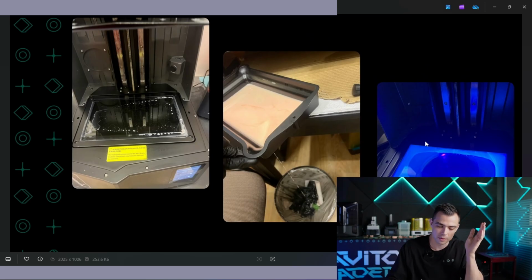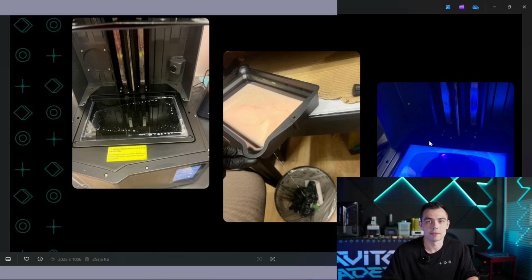Of course, it is a mistake. Of course, we bought a new printer, but at least we had time to do it. So please never ever do surgical guides just before the surgery. Leave at least one day before surgery in order to avoid mistakes, in order to avoid problems, and at least to have some time to correct everything you have to correct.